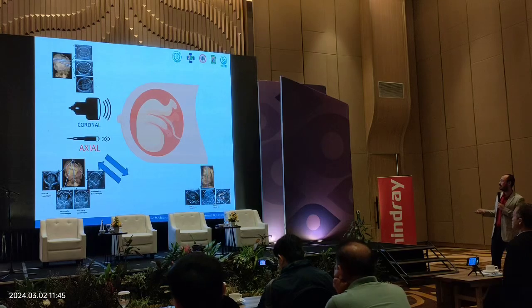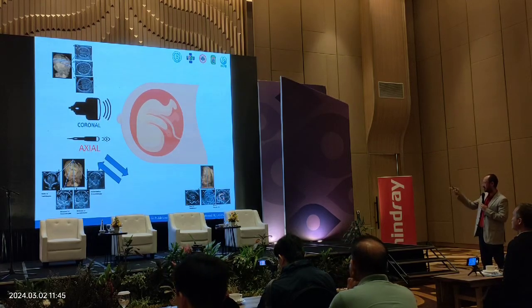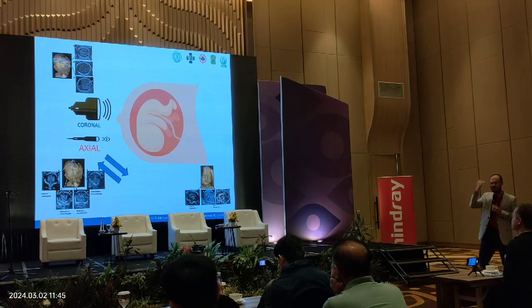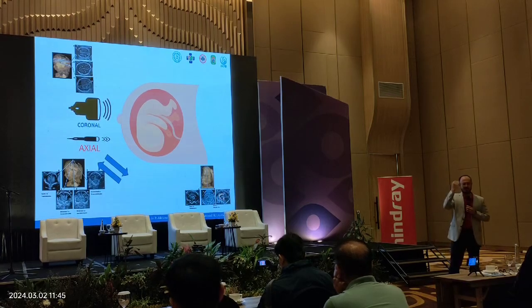This is a picture to describe how, if we have a fetal breech presentation or head presentation and we make a slicing like here, we can only see the transthalamic plane, transcerebellar plane, and transventricular plane.